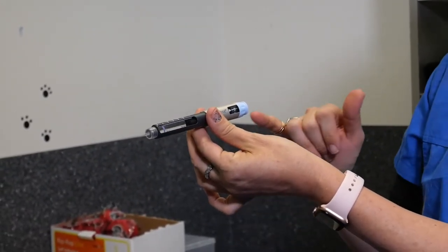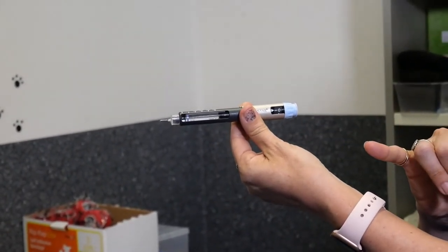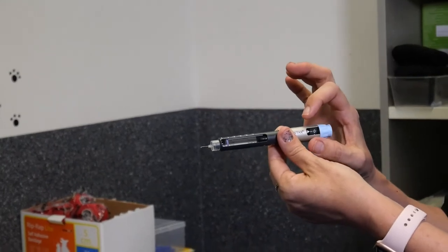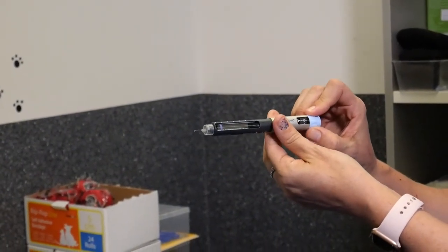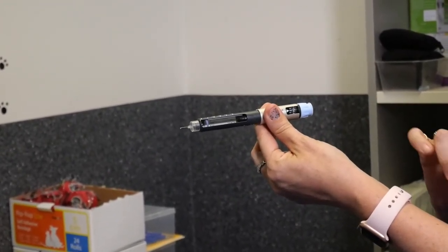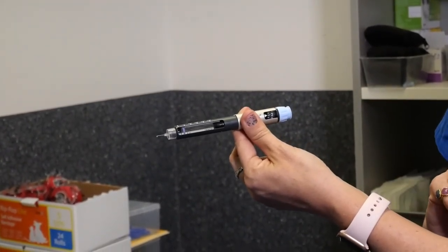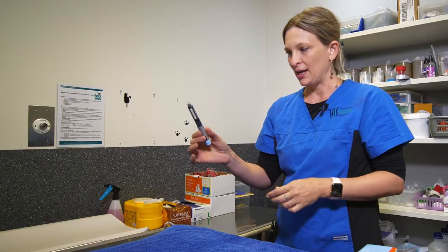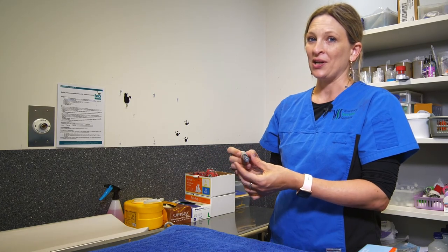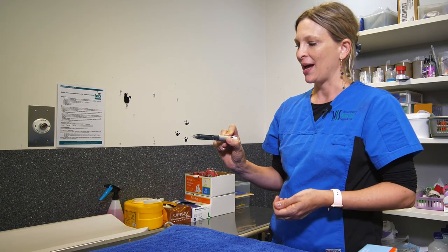If we look back at the dosage window, you'll see that it has now returned to zero, which means the pen is primed and you're now ready to turn the dial to the correct dosage for your cat. For example purposes, we'll say our patient is on a two unit dosage, so we've turned to the number two, and we'll then inject the insulin into our cat. We'll have another video that will show you how to give an injection to your cat shortly.